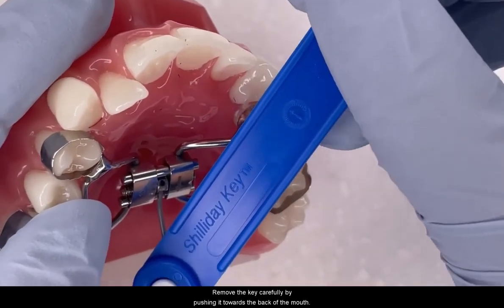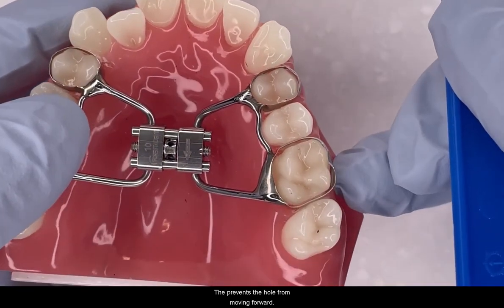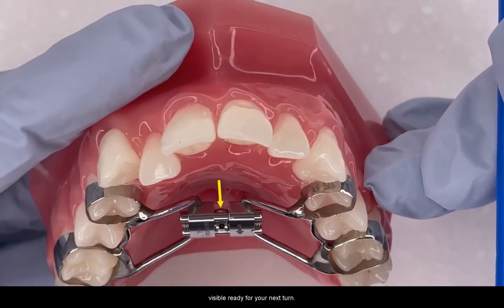Remove the key carefully by pushing it towards the back of the mouth. This prevents the hole from moving forward. You want to make sure that you can see the next hole visible ready for your next turn.